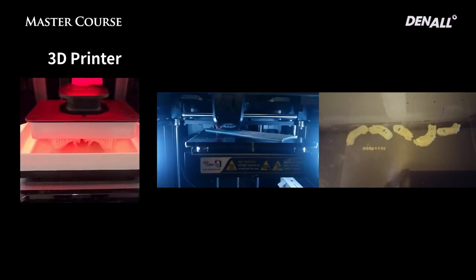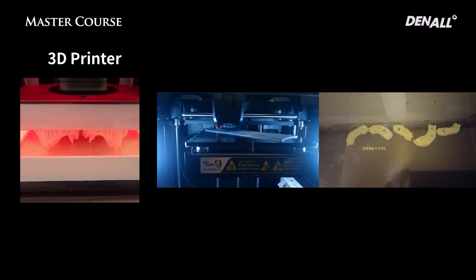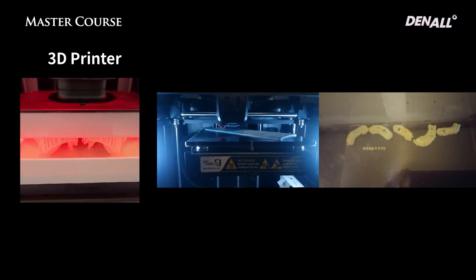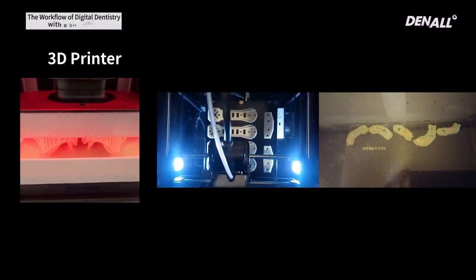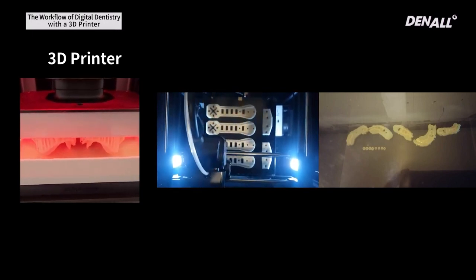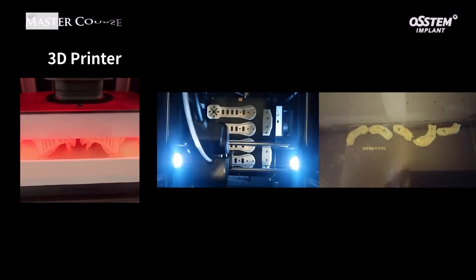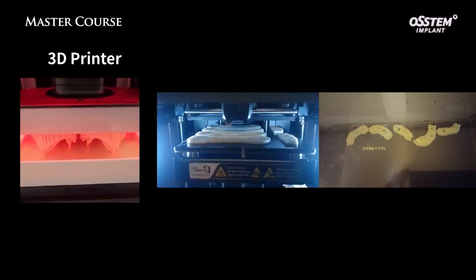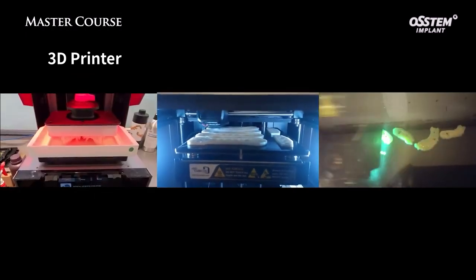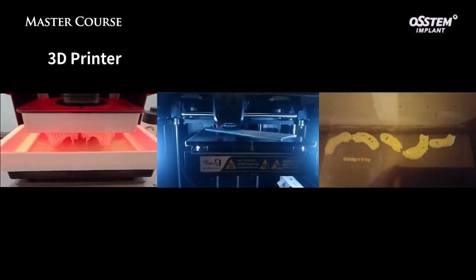In my dental clinic, this is the 3D printer that I use. Denture is being printed out. FDM printer is used to fabricate different appliances and tools for treatment. What you see right now is when my older son was very little, I made the frame of the drone using the printer at my dental clinic. There are 3D printers that fabricate surgical guides as shown.